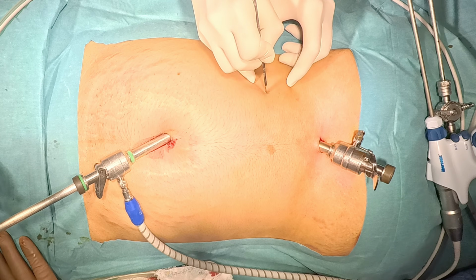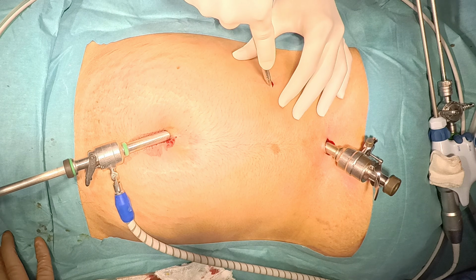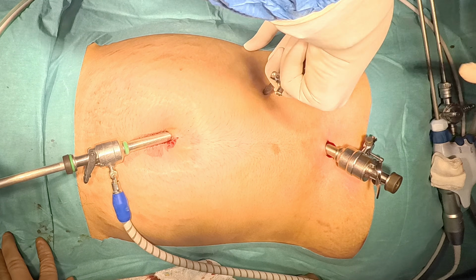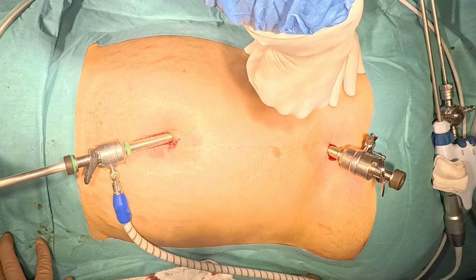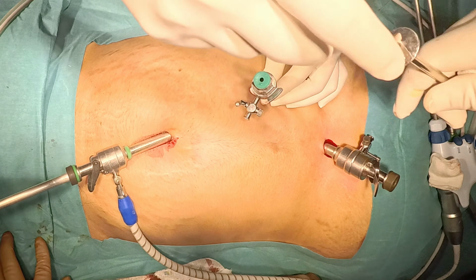The third port you can ask your assistant to introduce. This is at the mid-clavicular line just below the costal margin, or if the liver is enlarged then you can put it just below the fundus of the gallbladder. So, this is the third port that will be the surgeon's left hand for the atraumatic grasper.